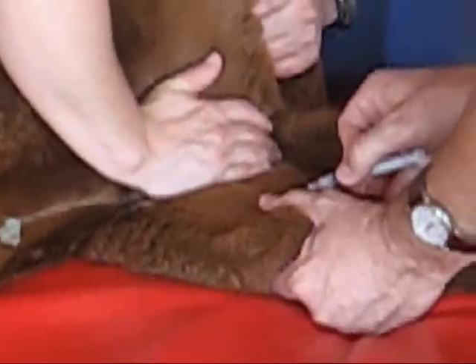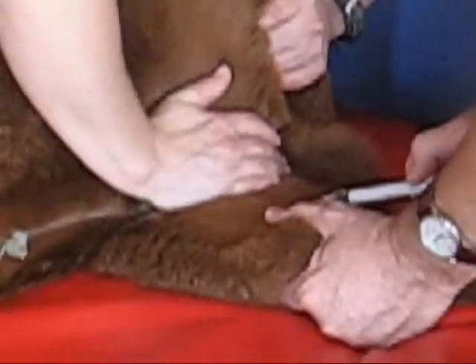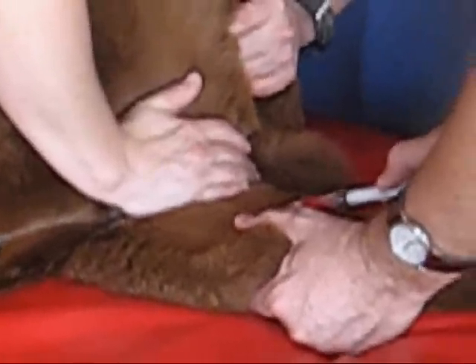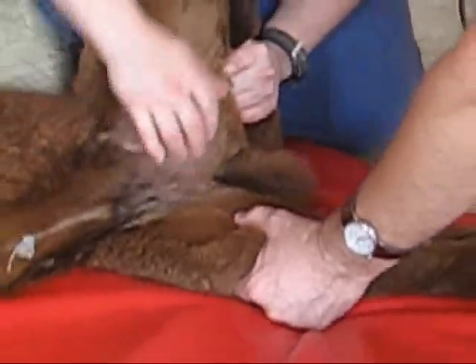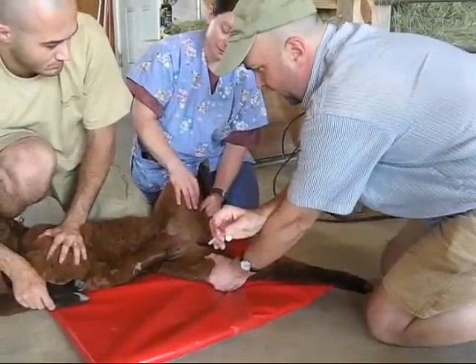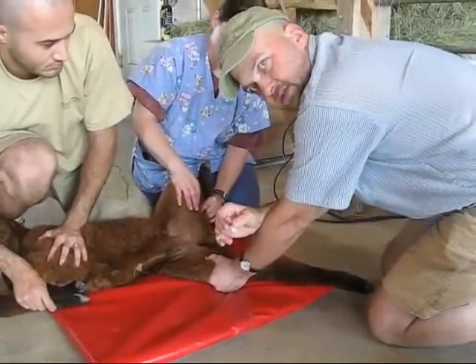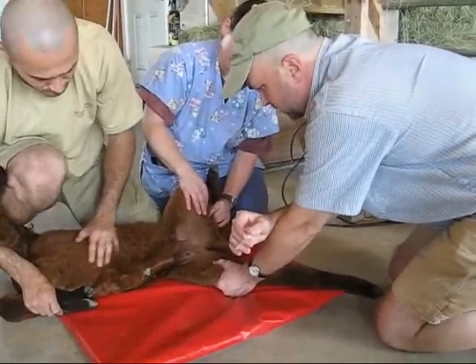My first try, so let's see how it goes. There you go. We quickly grabbed three cc's from the leg. I suppose that is a lot less scary than going through the jugular, and it actually worked quite easily.